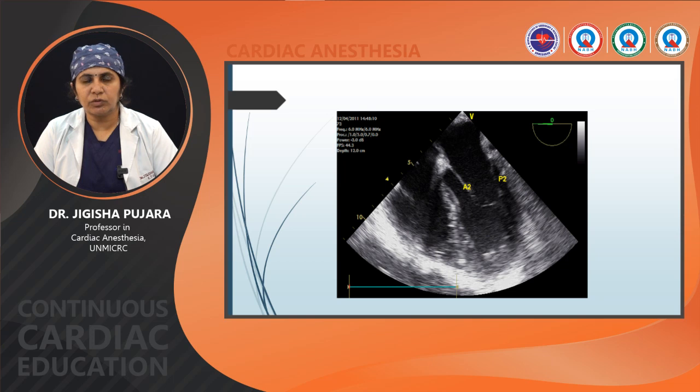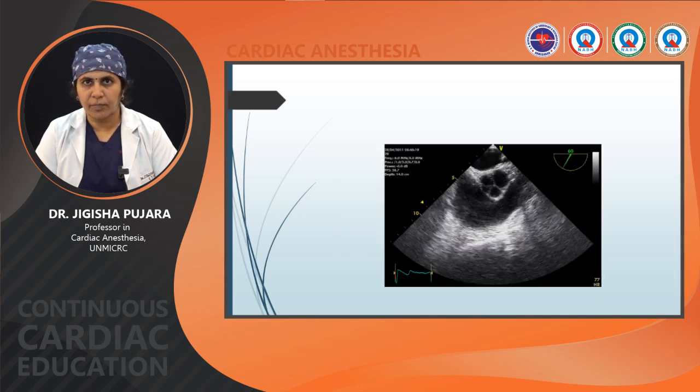Mid-esophageal four-chamber view. This picture shows the RV in the mid-esophageal four-chamber view. And this is the inflow-outflow view.